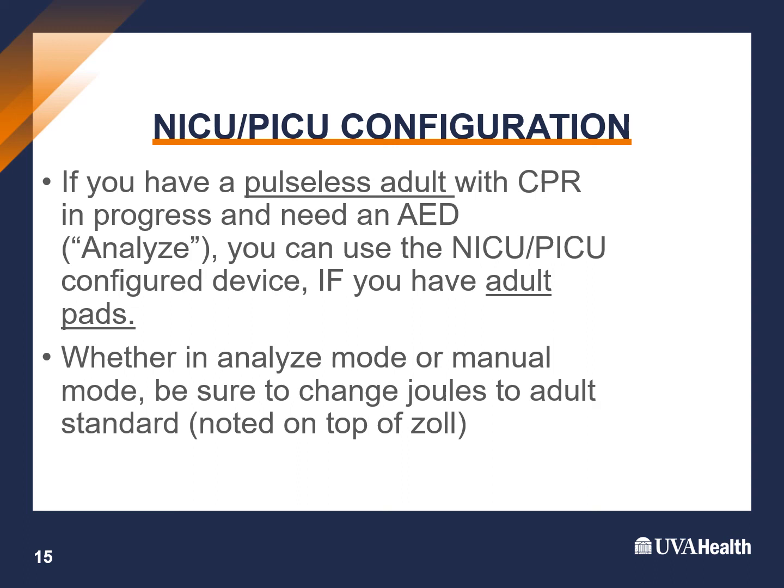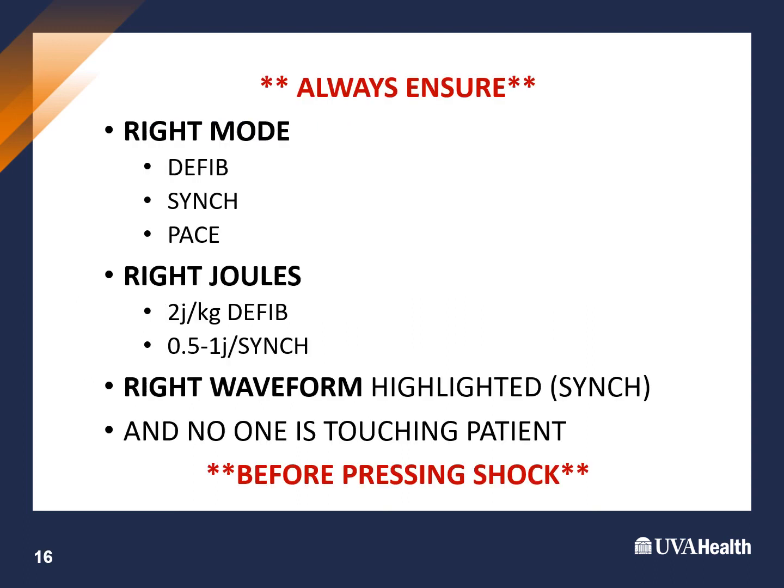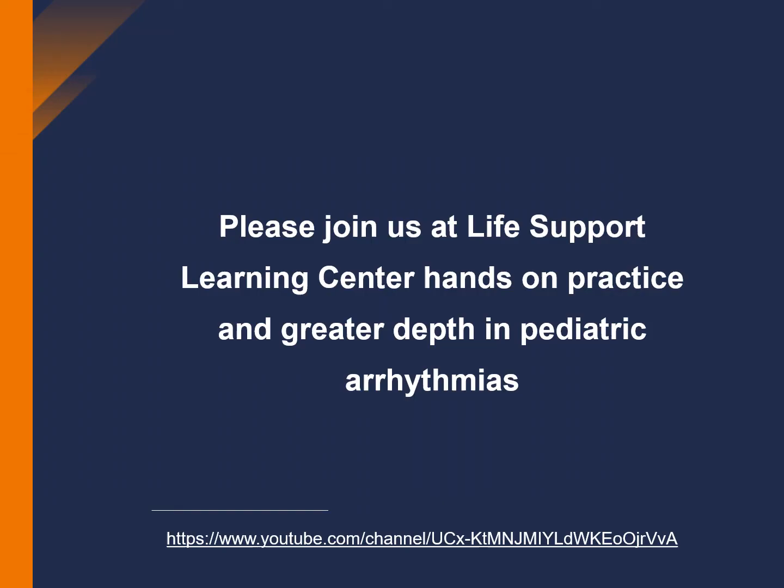When in doubt, look at the top of the Zoll and it will show you what the adult joules would be for each rhythm that you are trying to treat. So just refer to that. Again, always make sure you're in the right mode. You have the right joules programmed. You're on the right waveform if you're in sync, and that no one is touching the patient.